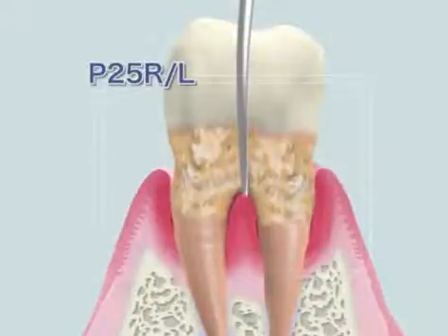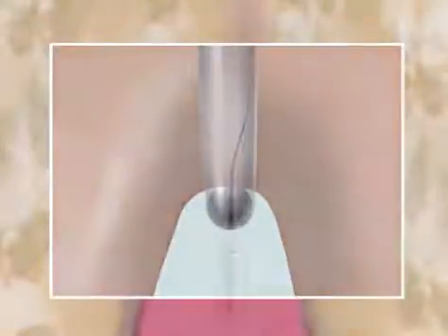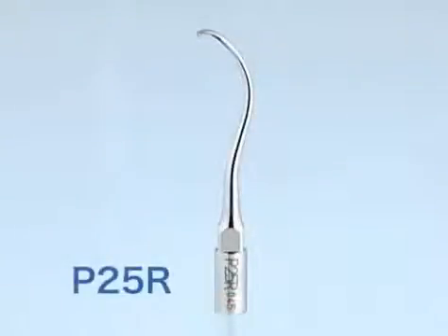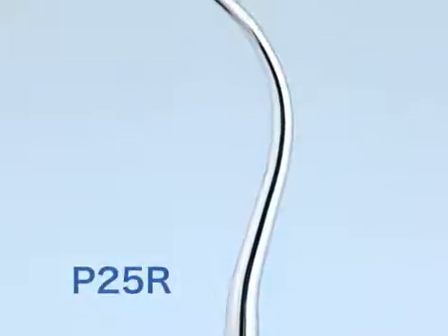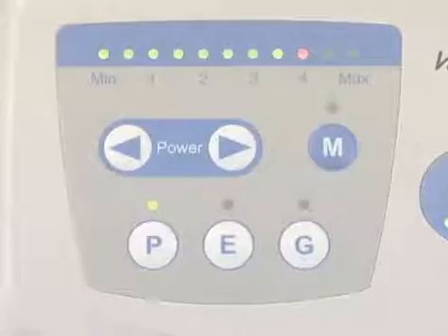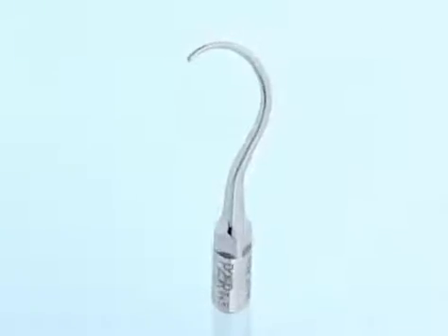Various 750 tips P25R and P25L are very effective in a case like this. For these very thin tips, power is set at P mode minimum to 4. High power can be dangerous and should be avoided, as it may cause fracture of the tip.